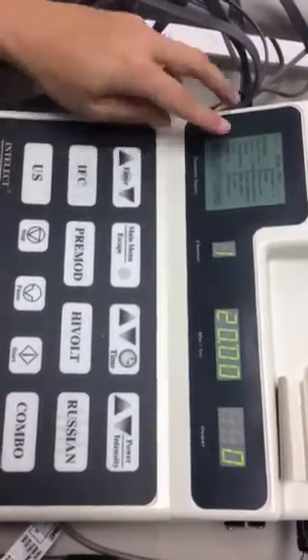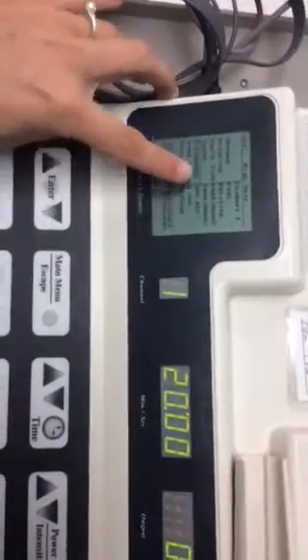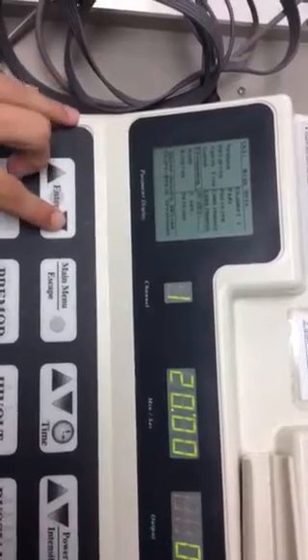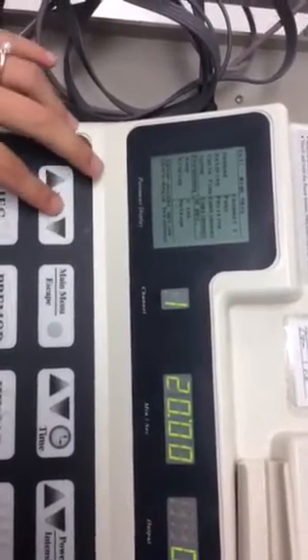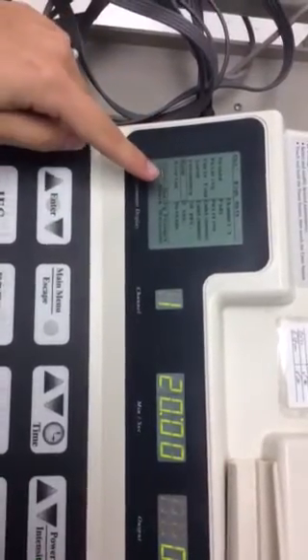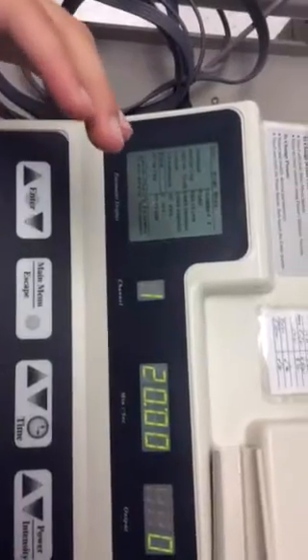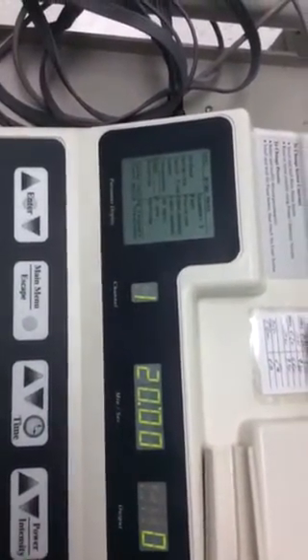Hivolt. With Hivolt, again, you're wanting a muscle contraction. The frequency is going to be based on the type of muscle that you're wanting to contract. If I want to do a postural muscle, we're going to do 30. Ramp is good at setting at 2. It's going to take 2 seconds to get up to its max voltage and then 2 seconds to ramp down out of the max voltage.